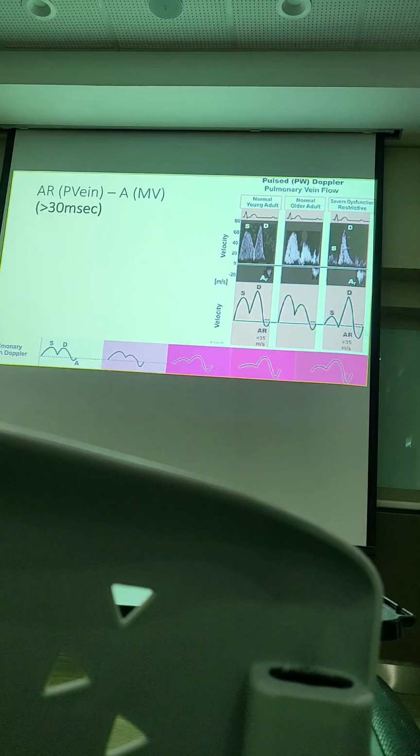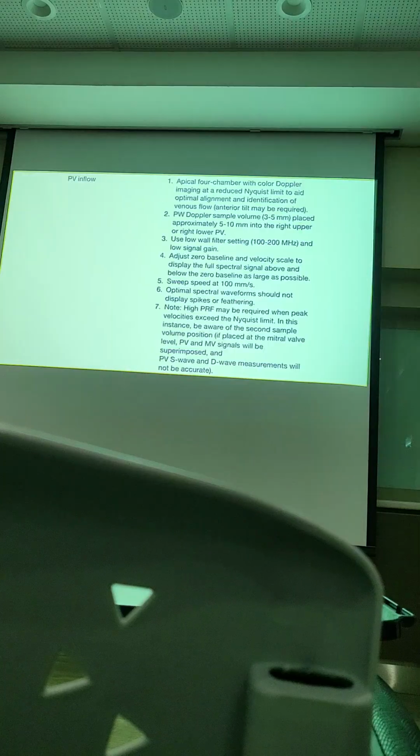So the longer and the taller it is, this signifies that the LA pressure is high, and this is also one of the parameters you can use when the first 4 criteria is not as helpful as you thought. So these are the extra parameters we use when the initial 4 parameters tak boleh digunakan. There are some cases the 4 parameters tak boleh digunakan. Okay, like patient with AF tak ada A wave, patient with MR, patient with MS, those are quite complicated.